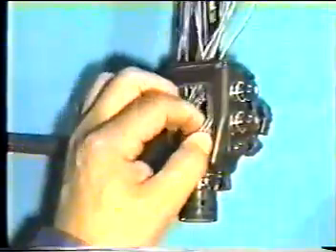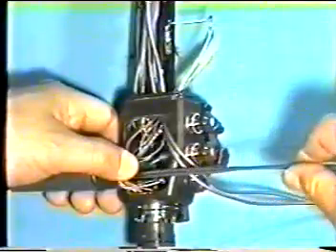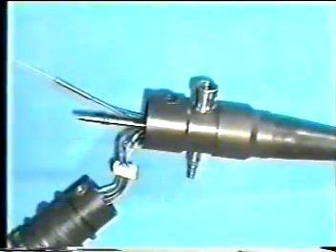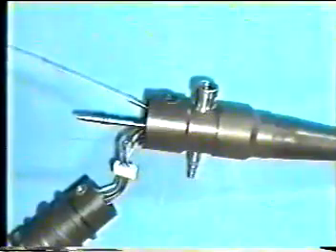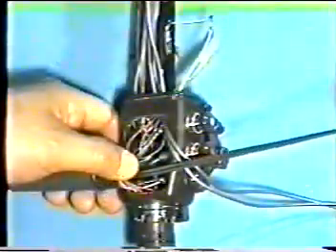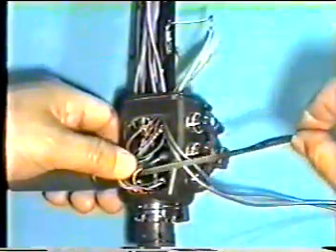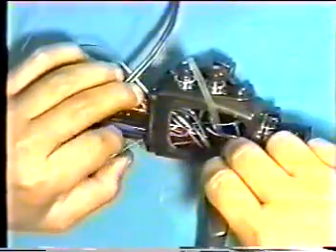Arrange inside of operating section so as to extract the light guide easily. Take out the light guide slowly with keeping the LG flexible section straight. The jig tube remained inside of the LG flexible section, so-called FSB, can be used for reinsertion of the light guide. Disconnect the guide tube and the light guide. Extract the image guide towards the distal end with a full care of broken fibers.